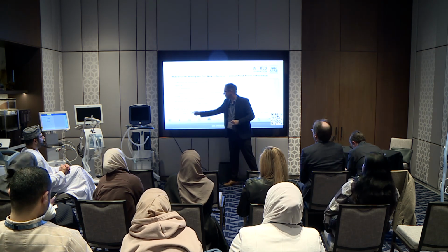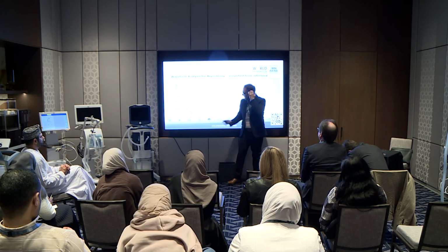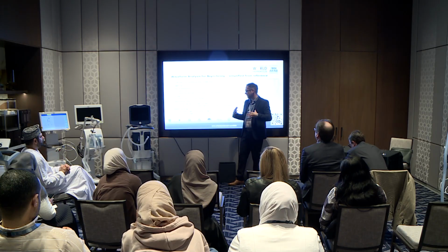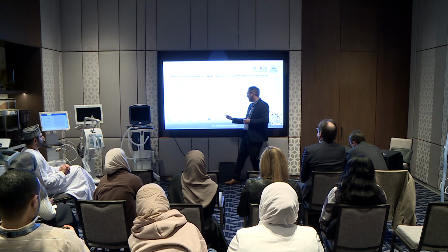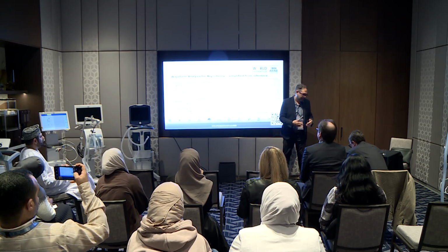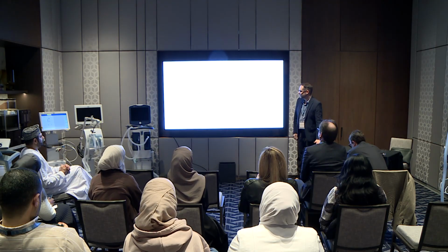Okay? Breath stacking is very obvious to define. You can see it very clearly. But it could be caused by either the patient has 2 breaths triggered by 1 strong inspiratory effort, or reverse triggering, the PMUS continues after a machine breath, and it continues into exhalation and then results in a second breath. It could happen, but it may not. So these are the steps. And now, get your phones out.